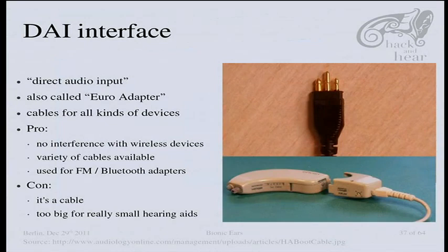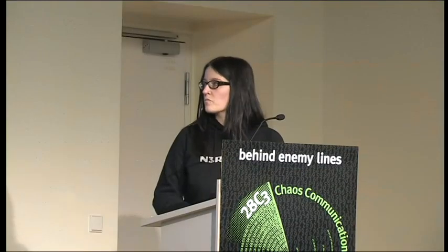So it looks like that, and it's usually connected to the hearing aid with some sort of shoe, which looks like that. And it has the pros and cons of cables. Of course, you feel like being on a leash, but you also have no interference with other wireless stuff. It's usually used to plug something else in, for example, FM or Bluetooth adapters. This is pretty old technology, but it's still around. Although for really small hearing aids, the plug is actually too big, so they leave it out.